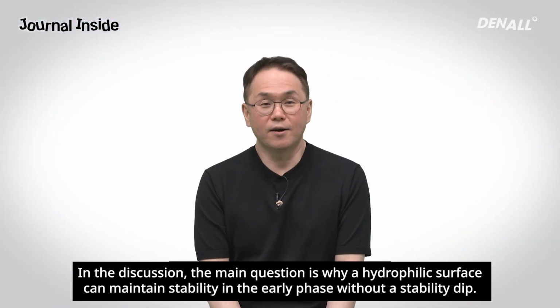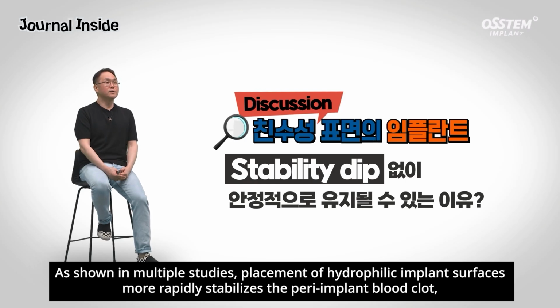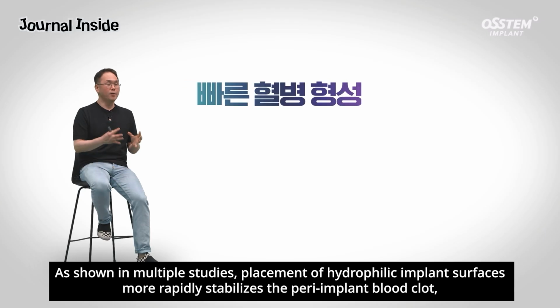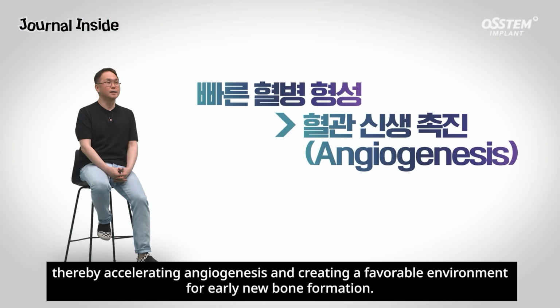In the discussion, the main question is why a hydrophilic surface can maintain stability in the early phase without a stability dip. As shown in multiple studies, placement of hydrophilic implant surfaces more rapidly stabilizes the peri-implant blood clot, thereby accelerating angiogenesis and creating a favorable environment for early new bone formation.